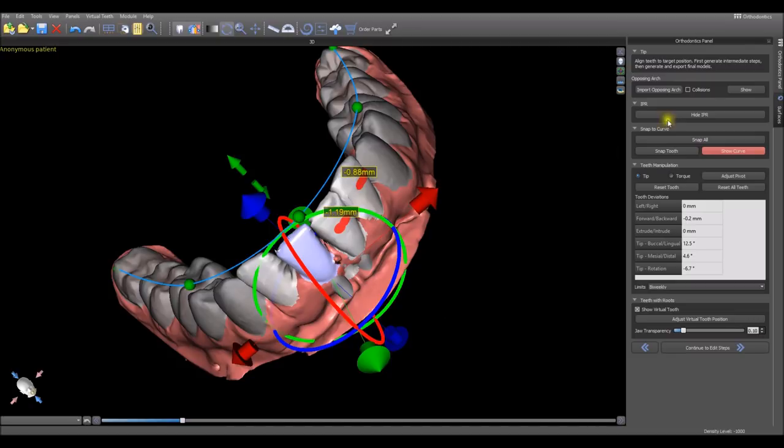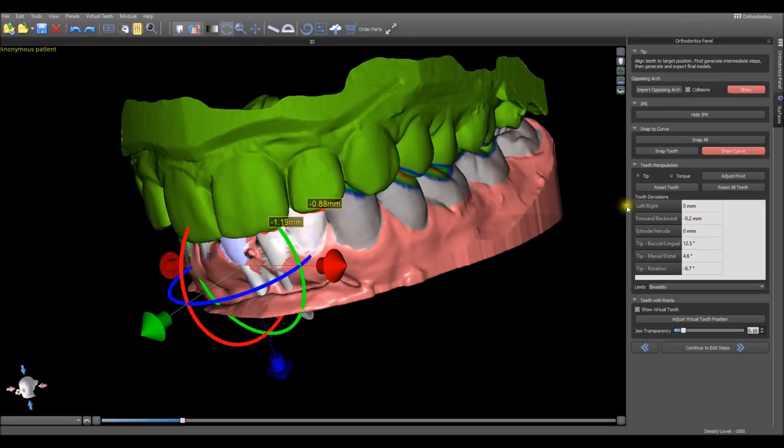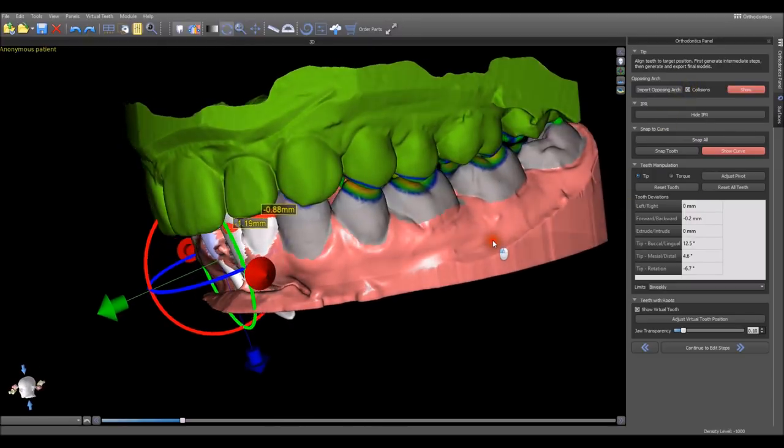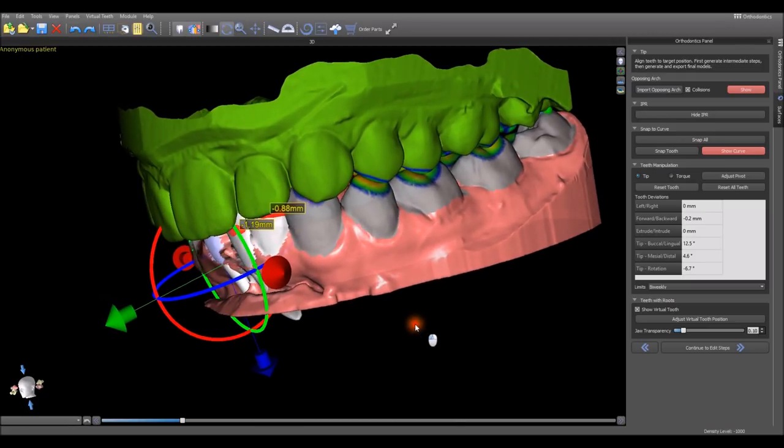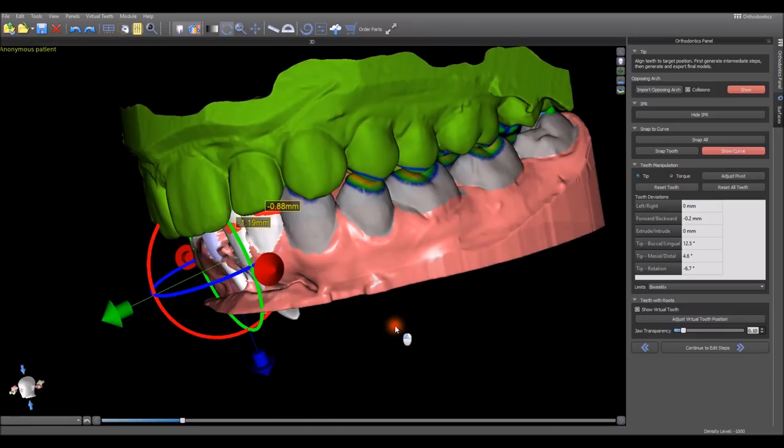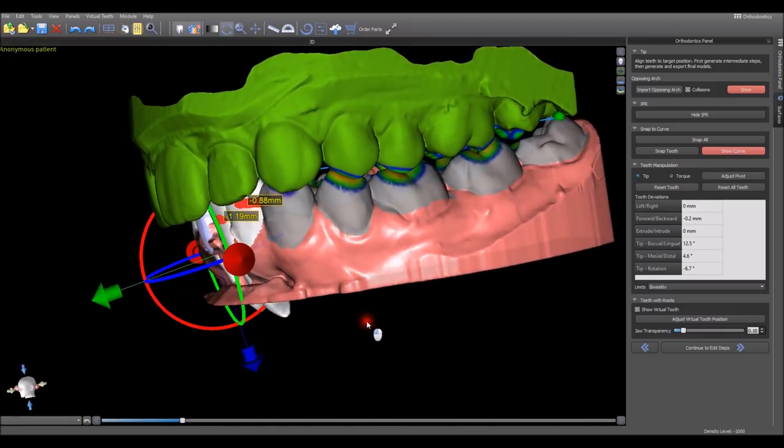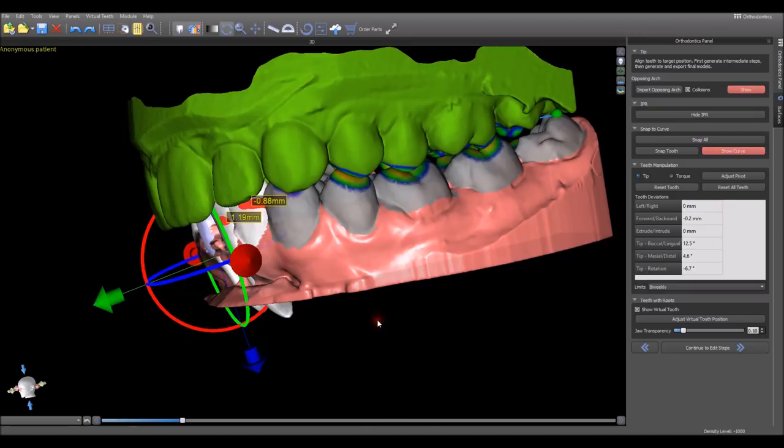We're able to turn on the opposing arch by pressing the show button. I've activated the collisions checkbox and we can see the color on the teeth going from blue to green to yellow to orange and to red if there is a direct collision. That's providing us a color visualization of the proximity of the teeth.